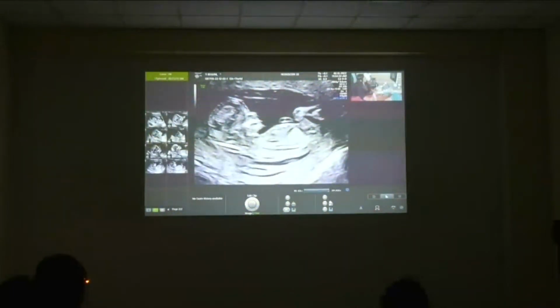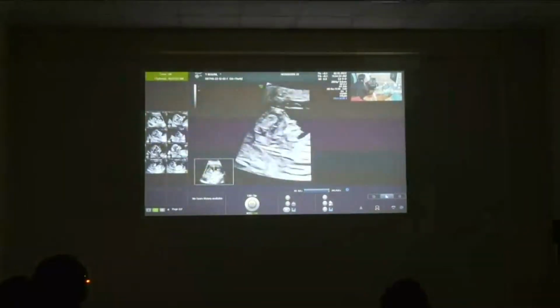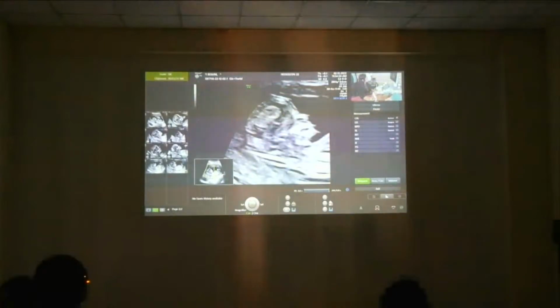So this is the nuchal translucency. We have to take a few measurements because I go for the best one. This looks fairly ideal. I'll take this also in case I don't get it later. Here the diencephalon is not very clear, but we see the intracranial translucency, the nasal bone, and the skin, which is parallel, with the echogenic tip of the nose.